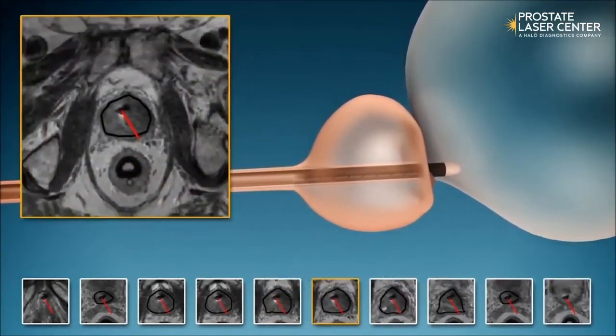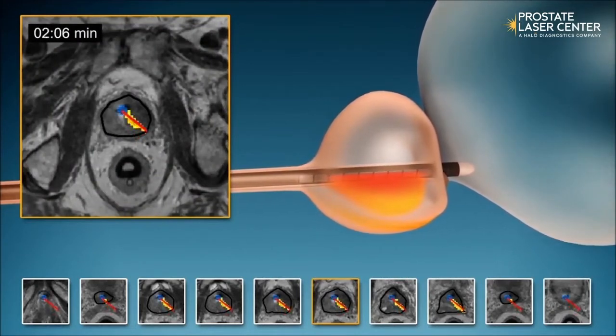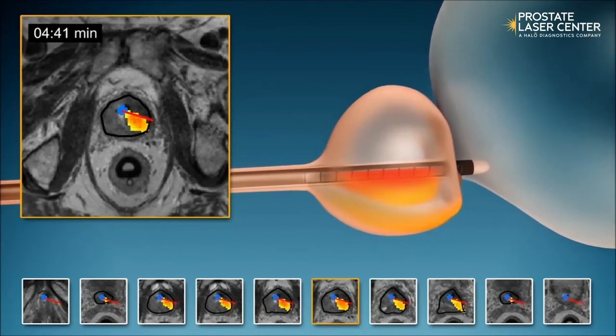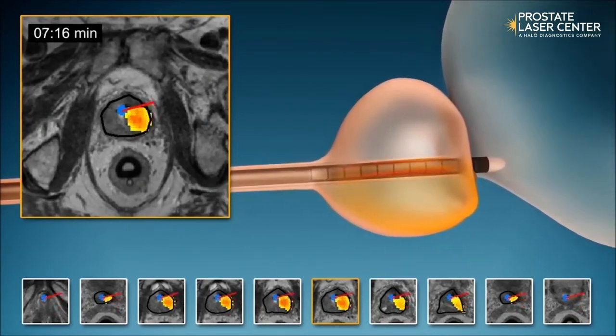During the treatment, the MRI machine provides real-time heat maps in 12 separate slices. At the same time, the Tulsa applicator device is rotating and sending out beams of ultrasound energy, which heat up or ablate the prostate tissue.